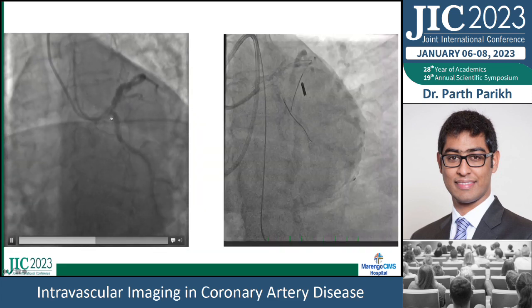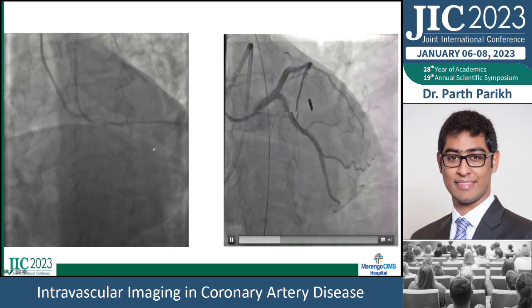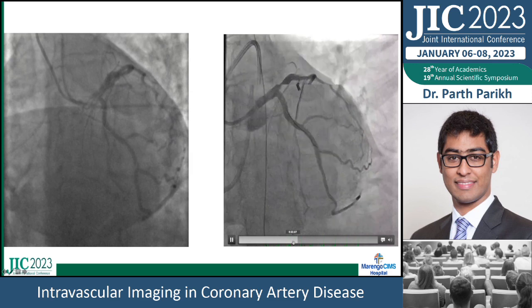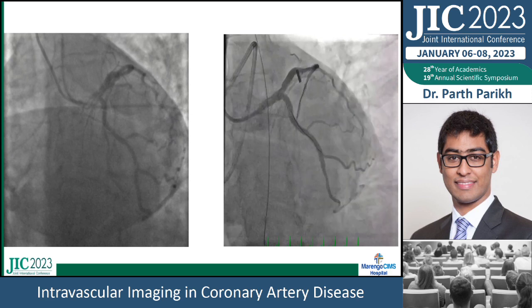So now looking at this image, left is pre and the right is going to be post PCI, and you can see the difference in terms of the angiographic result as well, just in terms of how much good result we can obtain using intravascular imaging.